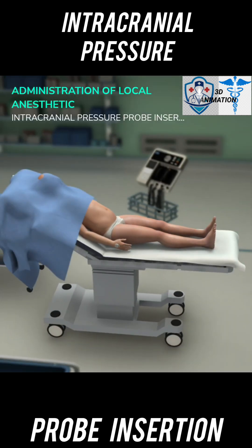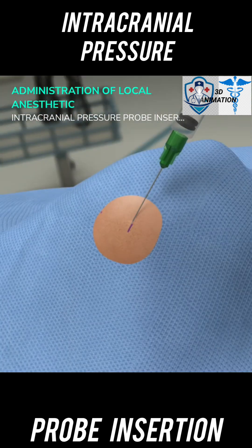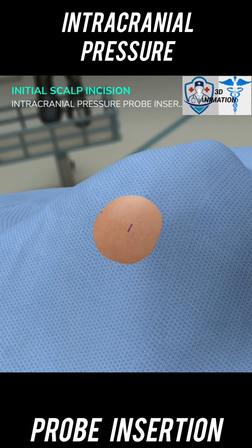Drape the field with a sterile drape. Select the syringe with 1% lidocaine and 1:100,000 parts epinephrine. Use the syringe to infiltrate the skin at the insertion site.